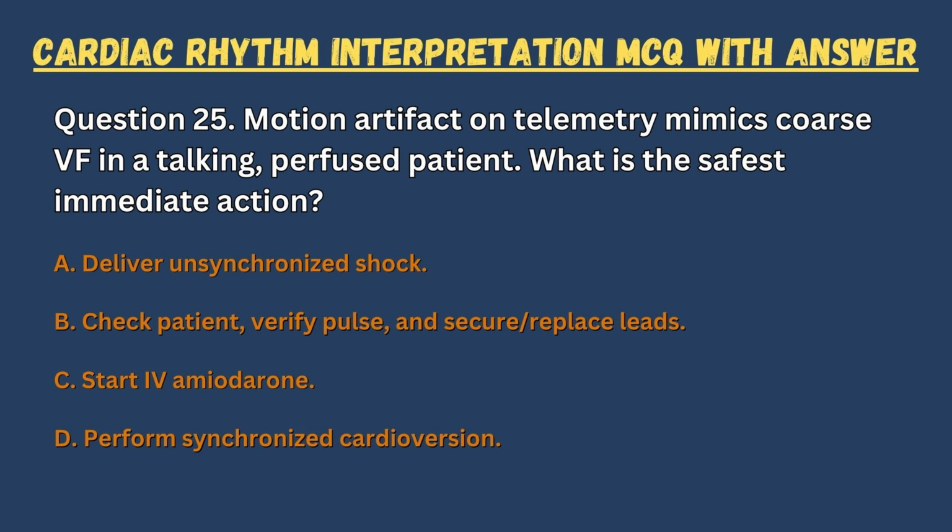Question 25. Motion artifact on telemetry mimics coarse VF in a talking, perfused patient. What is the safest immediate action? A. Deliver unsynchronized shock. B. Check patient, verify pulse, and secure/replace leads. C. Start IV amiodarone. D. Perform synchronized cardioversion.